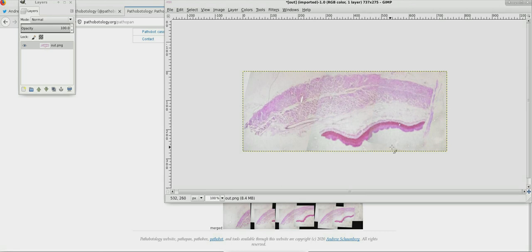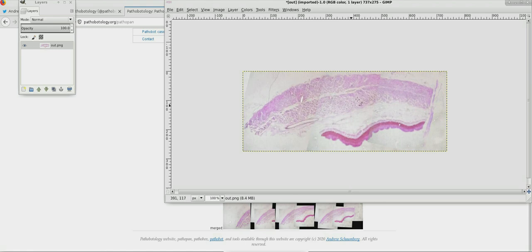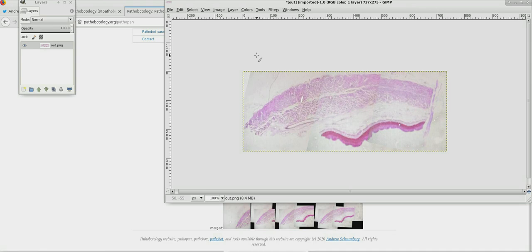And so you will notice some artifacts like that square here in the bottom. That shadow comes from the lighting at a microscope being a point source of light rather than a sheet source of light. So there is some shadow there for the artifact. There are more seams that you'll see, but again, this does not require any special equipment and you can get a low-resolution whole slide scan this way.